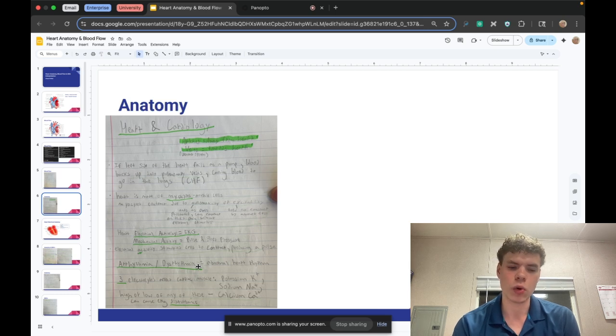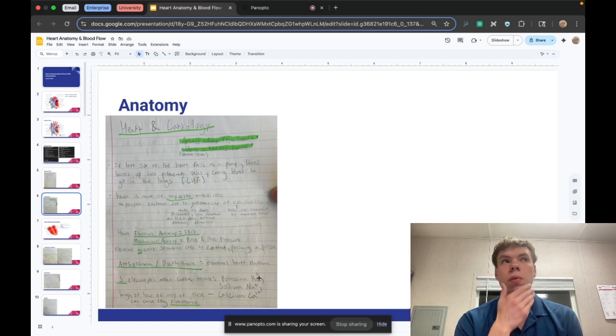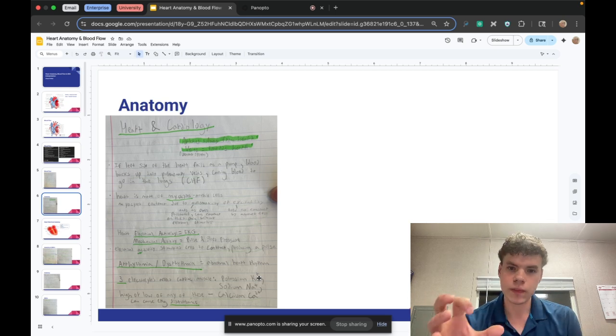Anything that's abnormal. So, for example, potassium, sodium, and calcium are three electrolytes, or three elements on the periodic table for any of you that have done a chemistry course, that affect cardiac muscle, right? So, if any of these electrolytes are out of whack or not normal, that can cause EKG disturbances. Once you study this for a while, you can look at a rhythm and read it, and say, oh, this person has high potassium, or low potassium, or high calcium, or low calcium.